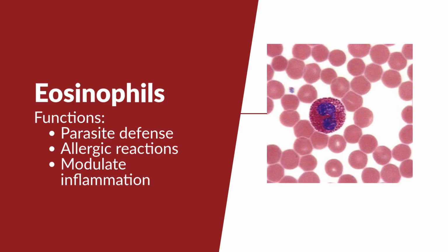So what's the difference between basophils and eos? Eos have orange-red granules. Their bilobed nucleus is visible, and they attack parasites and allergies. That's why they are more common. Basophils have dark blue granules. The nucleus is often hidden because of all the little granules, and they release histamine, and they are quite rare. So remember, orange and red is eos, dark and blue is baso.